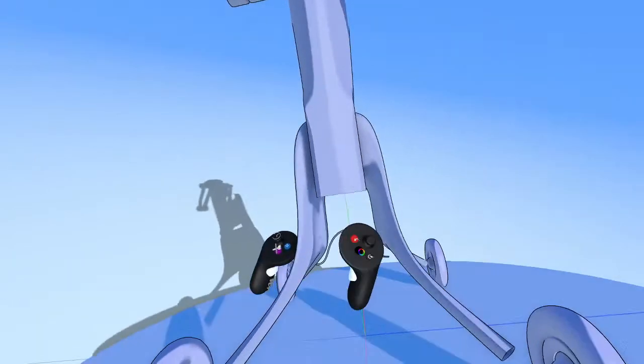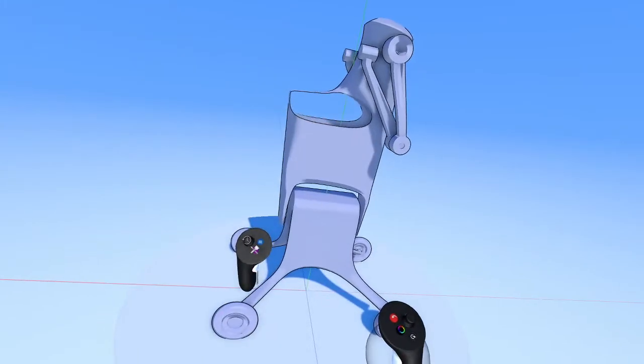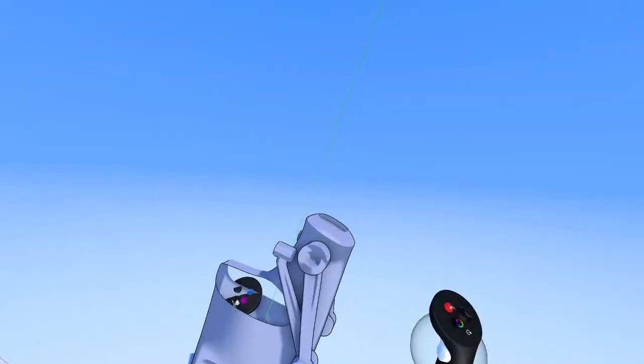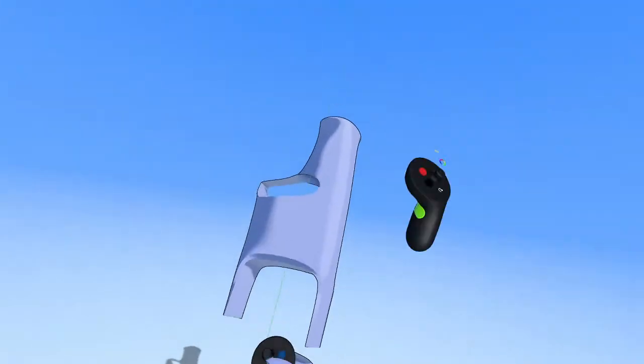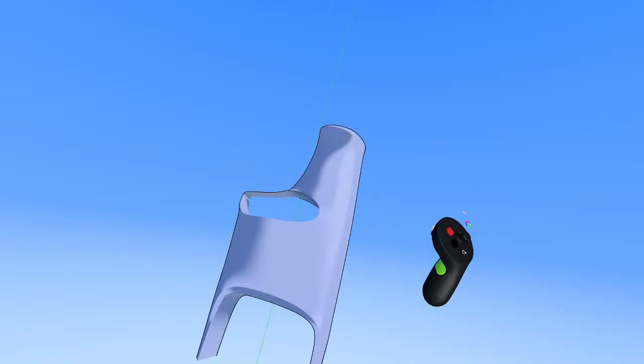Okay, as far as the legs go, you were right. I wanted to do that. I think we're going to come to that later. Or maybe we won't have time. But one thing I want to do is actually create the sensor housing up here. So what I'm going to do is actually duplicate up this shape.